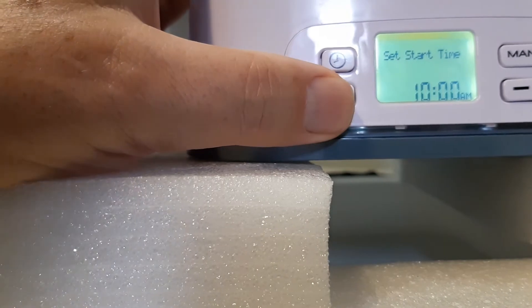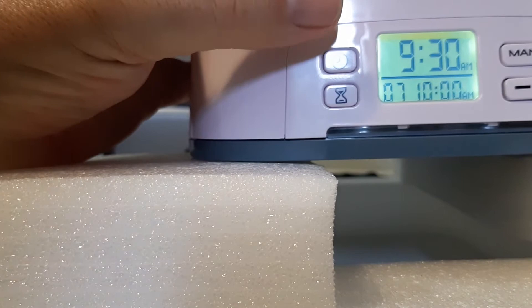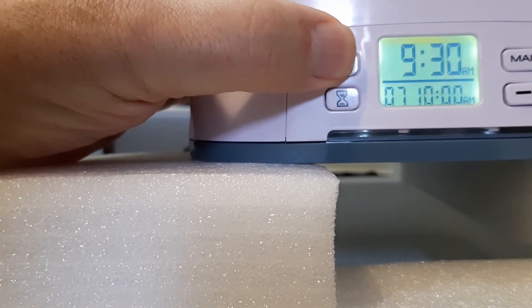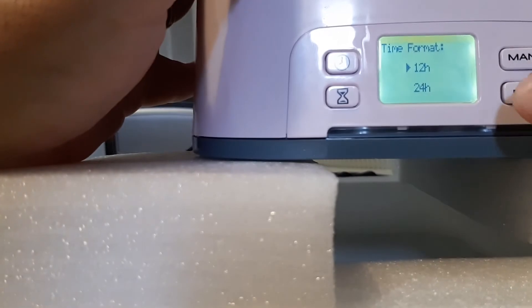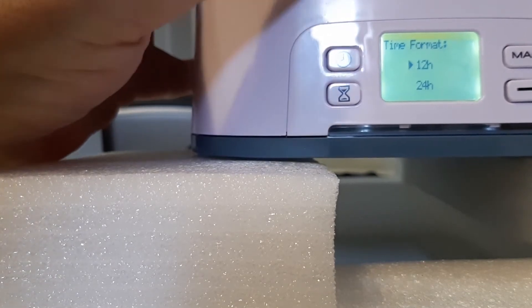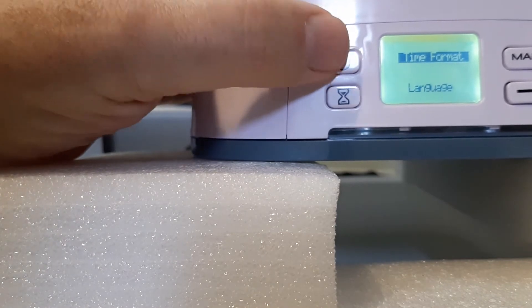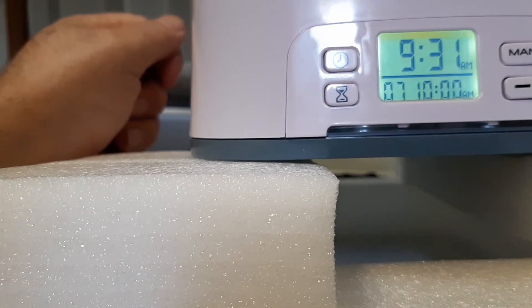So it's set for 10 o'clock — that's a good time for me. Hit that hour button again and now it's all set up. If you want to set this for 24-hour time, you hit the clock button plus this button, then hit the manual button, and that'll show you the 12-hour or 24-hour format. Just use the plus/minus. I'll leave it at the 12-hour format — I prefer that. Hit that back and now it's set back to 12-hour instead of 24-hour.